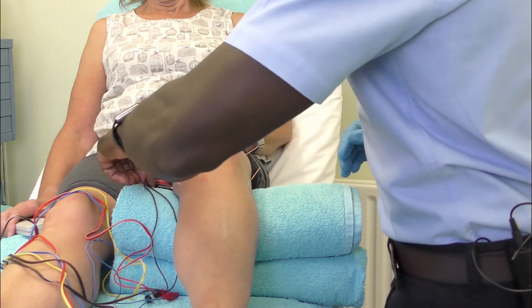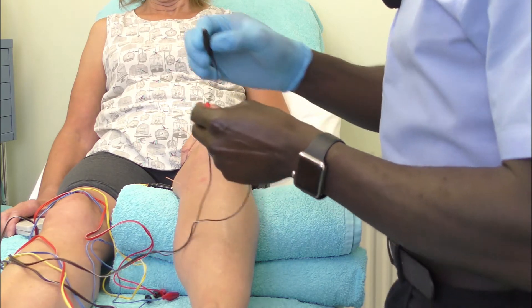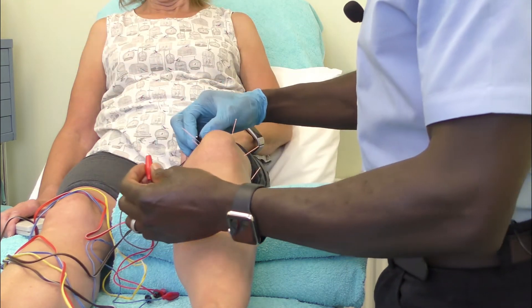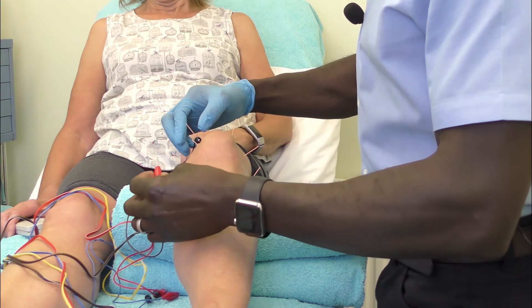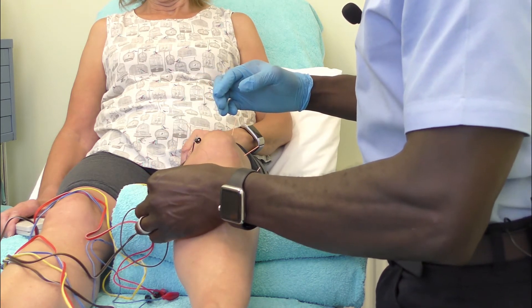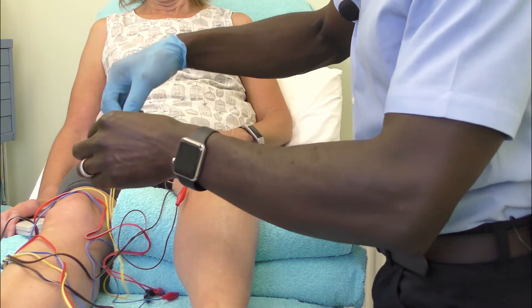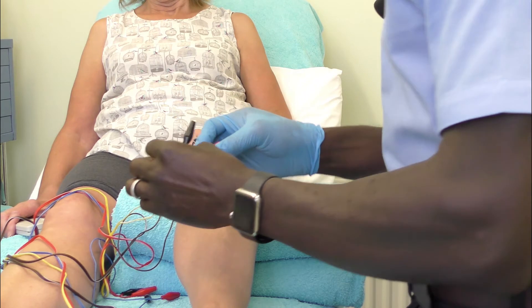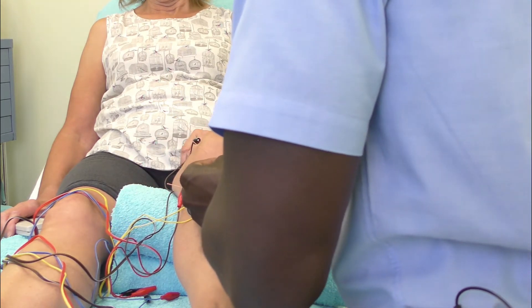Now we can start to connect our electrodes — try and keep them to the same meridian. So Spleen 9 to Spleen 10. With regards to the eyes of the knee, I'm going to put both electrodes to the eyes of the knee.